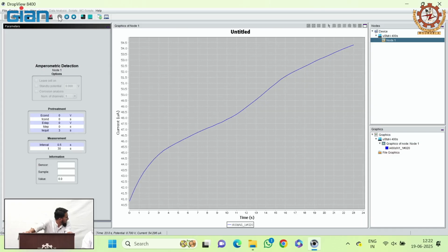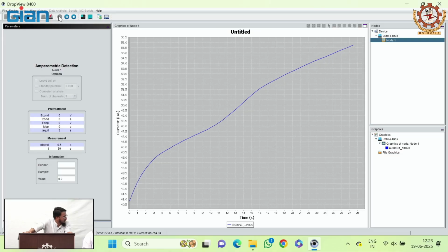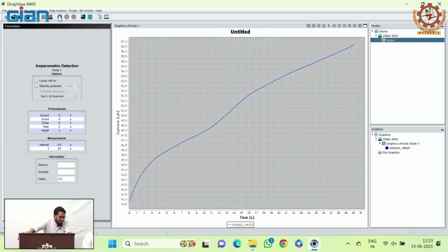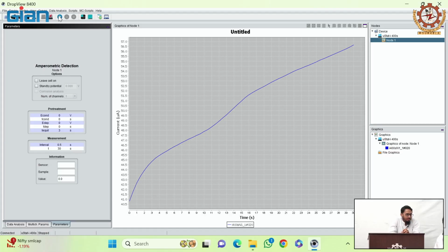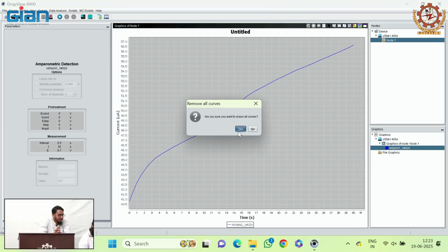There is a bit of instability, but we'll see. If the sensor is not working in this session, then we will repeat the same experiment, maybe debug it in the next session and try to make it work. Okay. It's around 57 microamps. We can go to the second one. Before the next solution, wash with DI water or PBS in between, maybe wash with DI water. So now we'll be doing 2.5 millimolar, right? Yeah.